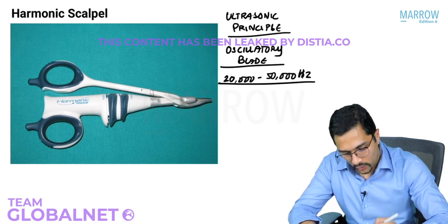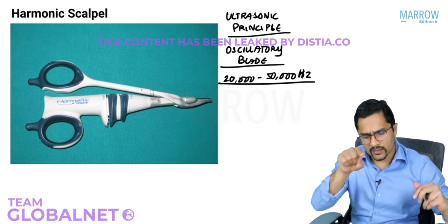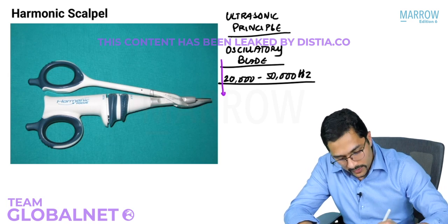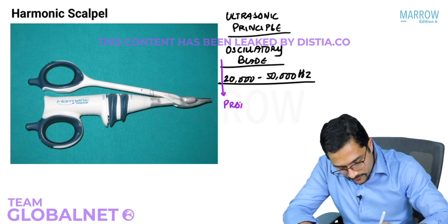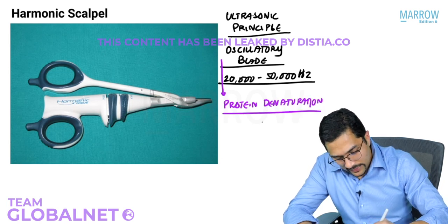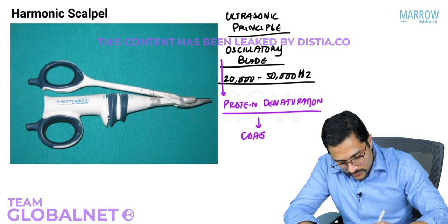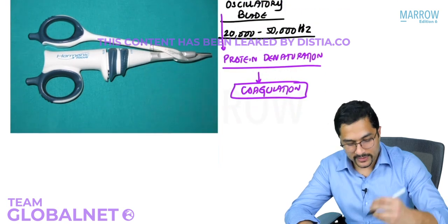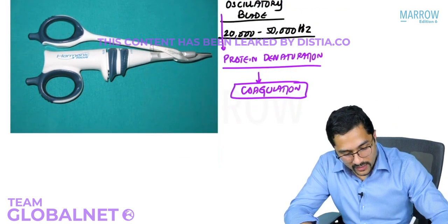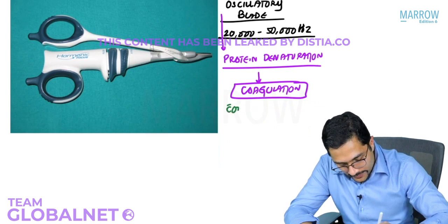So this blade oscillates between 20,000 to 50,000 hertz, so rapidly it oscillates. And because of this oscillatory movement, it causes protein denaturation, and this leads to coagulation. But what is the peculiarity about this coagulation? And that is the beauty of the harmonic scalpel, that this coagulation occurs without heat production.